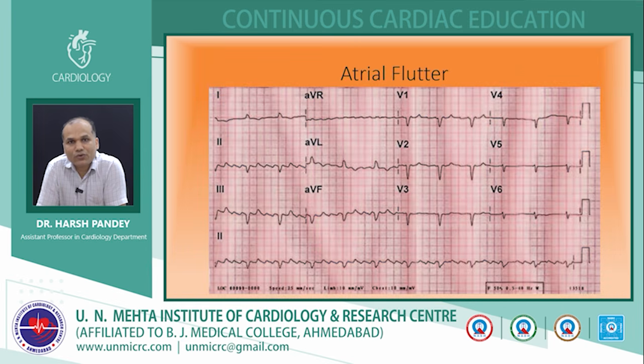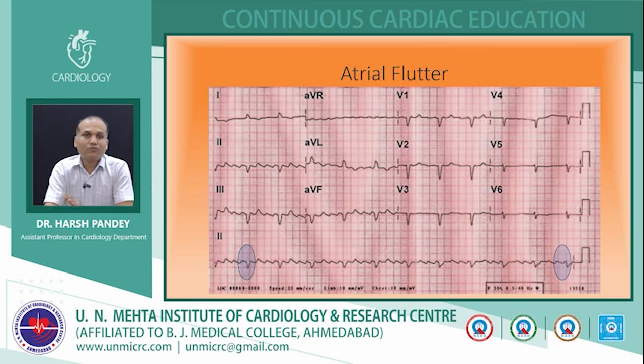In case of flutter also, you need to recognize whether the patient is having complete heart block or not. So in the rhythm strip, you have to observe whether the first beat and the last beat have a similar amount of PR interval, similarity between the PR intervals. If those PR intervals are different, there is a higher likelihood that the patient is having complete heart block.